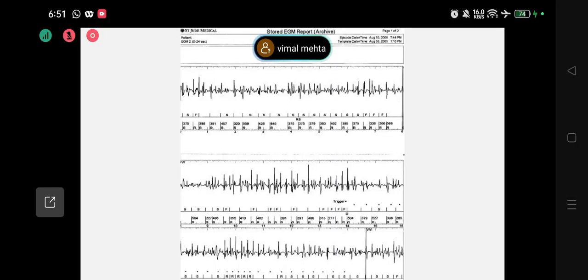Why was it oversensing? Beautiful answer, everybody. So that you remember it for the rest of your lives. Sir has already explained. It was sensing because there was a lot of electrical activity. Dr. Katuria, correct me please if I'm wrong. It was giving too many signals from myopotentials and everything. Is it true? Yes, because the lead is hanging in the air. It has come out, so it is sensing everything which is happening around it.